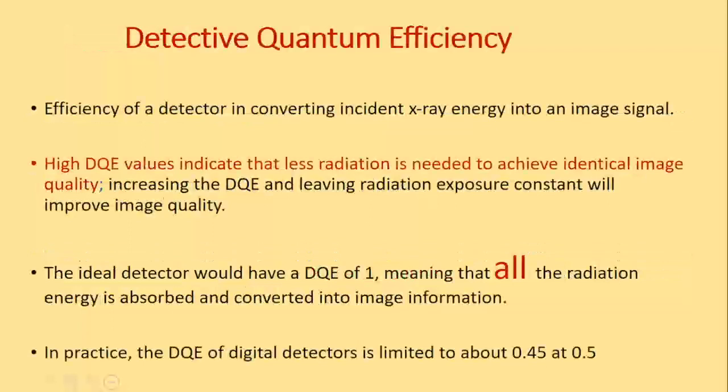One last point here before we move further. So we looked at pixels, we looked at spatial resolution, then we looked at wide dynamic range, meaning showing soft and hard tissue together. And finally, this is all we need to worry about: detective quantum efficiency. Like Dr. Shileka was mentioning earlier, we need to do a lot for our patients. We need to be really mindful of their needs. And this is where DQE comes in.